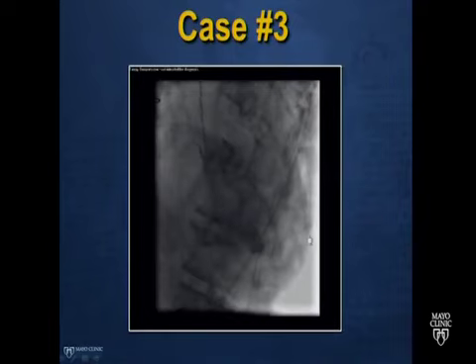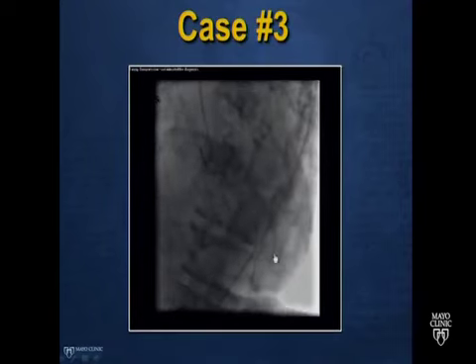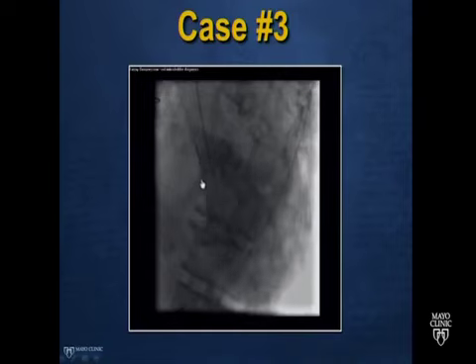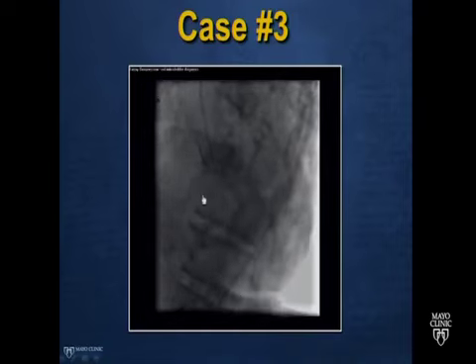And then finally, here's another one that you might see. There's an aortic prosthesis here. We're injecting dye in the LV. And again, if you got some vignette of a murmur, you would think of a VSD, and that's what this patient had. This patient had a perioperative VSD, membranous VSD related to the surgical AVR.